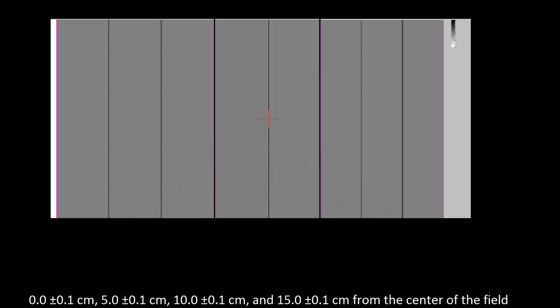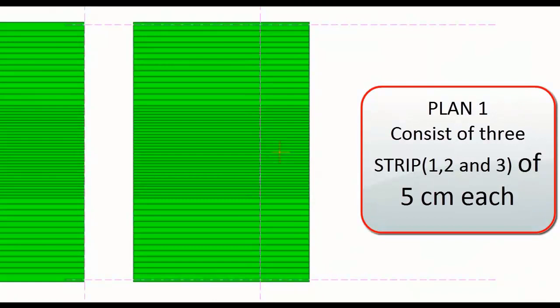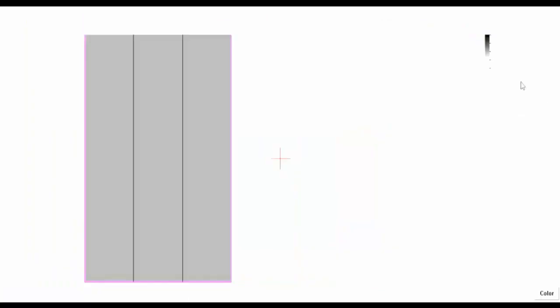Plan 1 is executed with the MLC to expose three strips on the film. Strip 1 and strip 2 each have a 5 centimeter width. First strip 1 is exposed, then strip 2, and then strip 3. With the help of plan 1, three strips of the film are exposed: strip 1, strip 2, and strip 3.